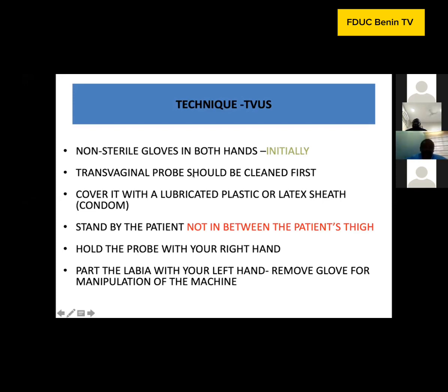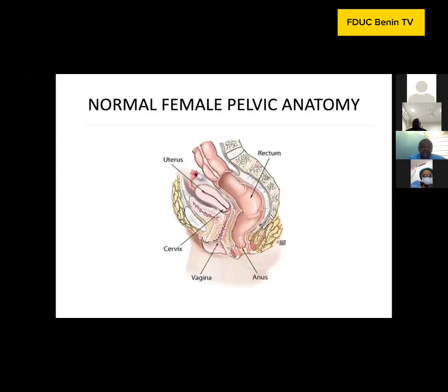Before this, you know about how to lubricate it. Remember to lubricate the tip of the probe. So we're going on to the anatomy, refresh your anatomy. You all have a clear understanding of anatomy. You know that the symphysis is in front and the sacral spines are behind.